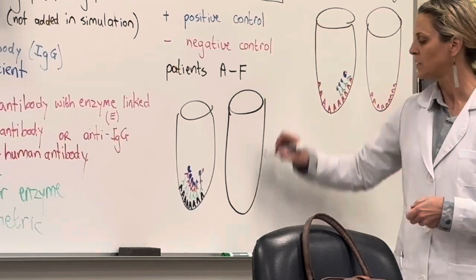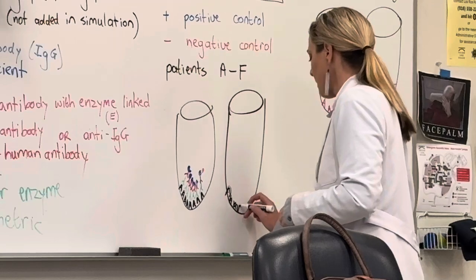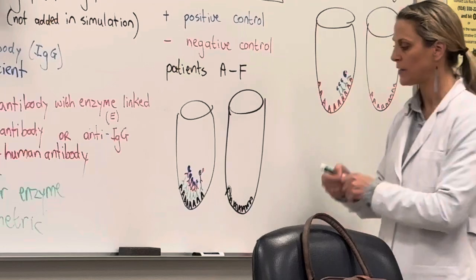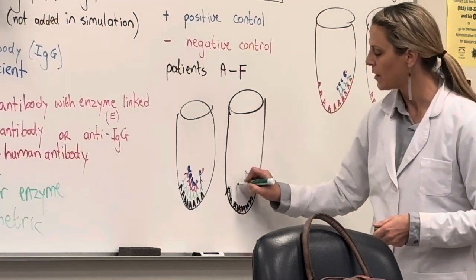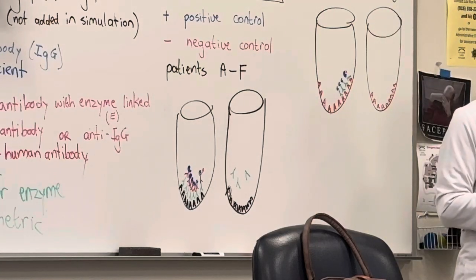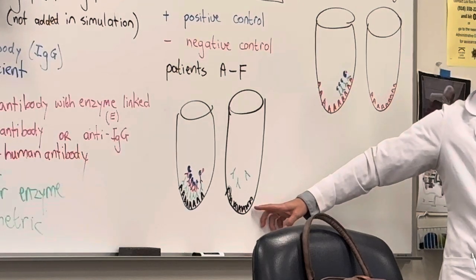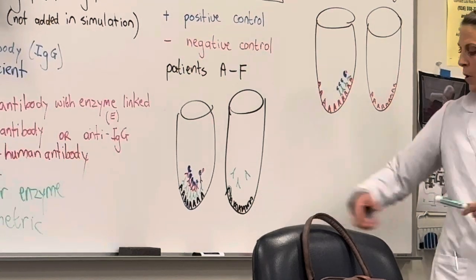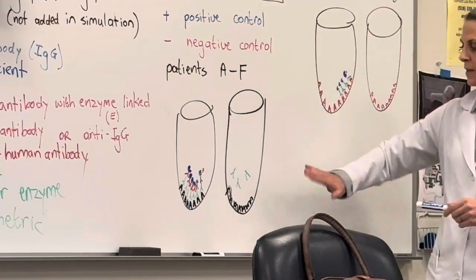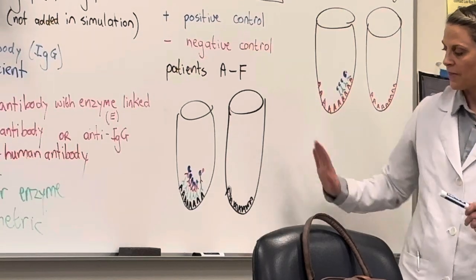So here's our antigens that we already bought. Then what happens is our patient's serum comes in here. There are antibodies in our patient's serum, but they're not going to stick to anything, because our patient doesn't have antibodies directed towards that antigen. Does that make sense? Hypothetically, if we didn't wash that... we're going to wash it. So we wash out everything else that doesn't stick, nothing's stuck.